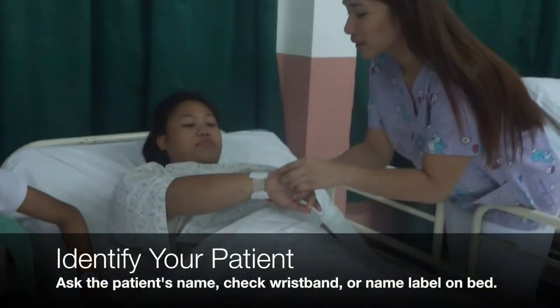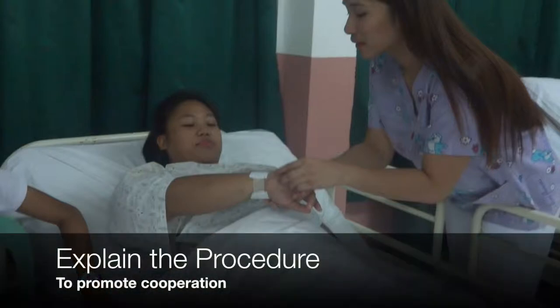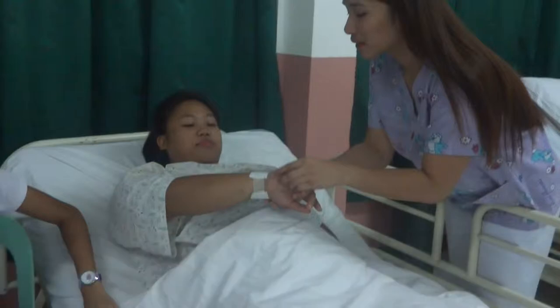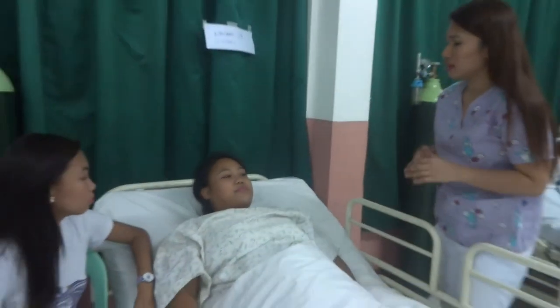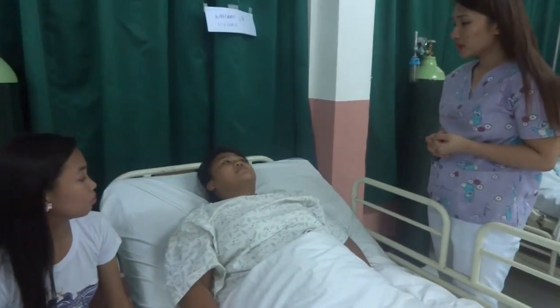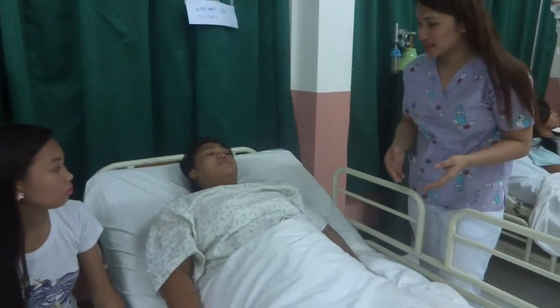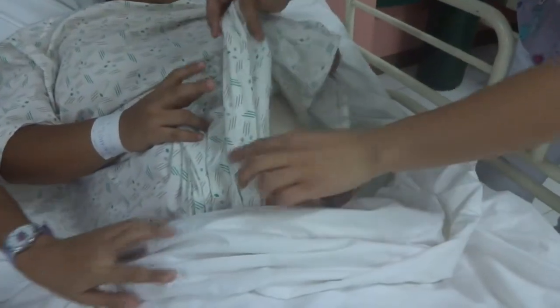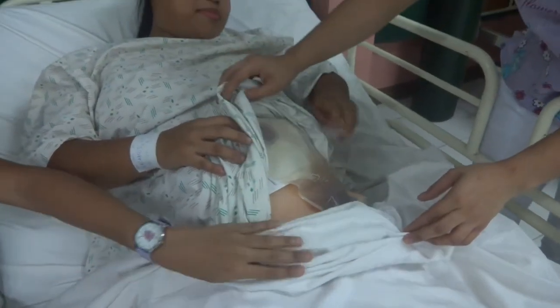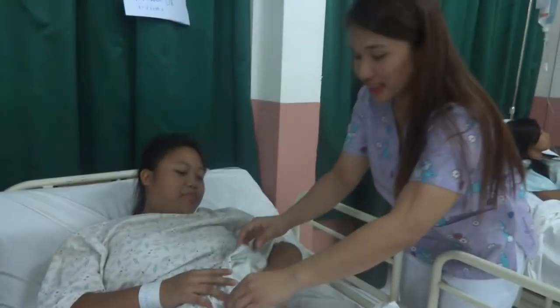Next, identify your patient. Check the wristband or the name label on the bed to ensure you have the correct patient. Explain the procedure to your patient to promote cooperation during the colostomy care. So how are you? Do you feel any pain? Your daughter said your colostomy bag is full — may I check it? It's already full. Okay, let's check.